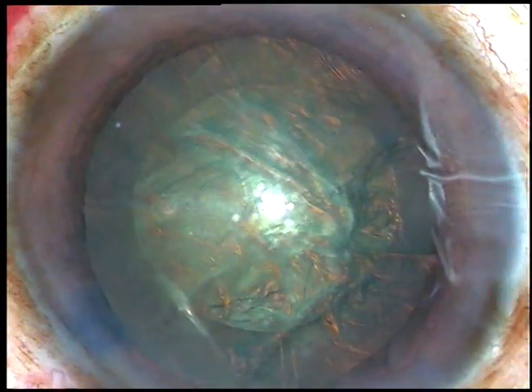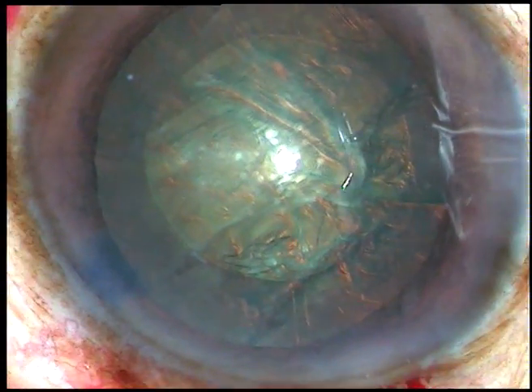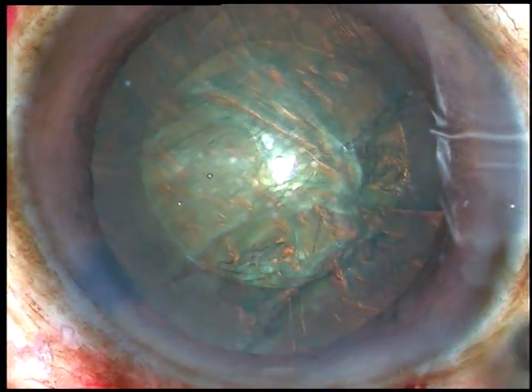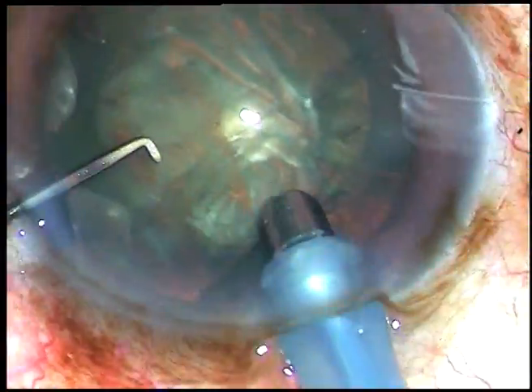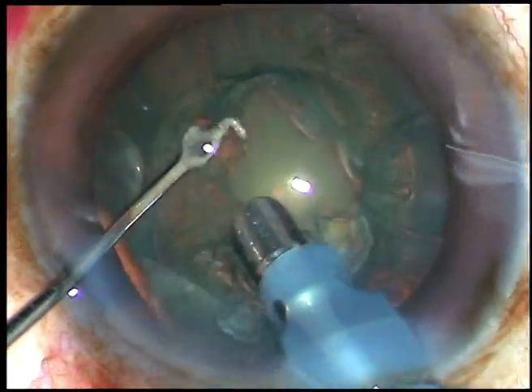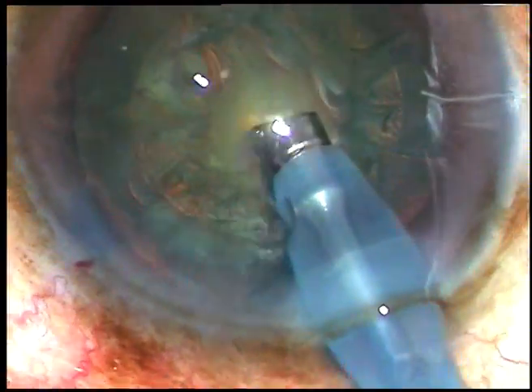Now is the time to introduce the tip of the phaco handpiece. The tip is introduced with its bevel down — this is a 30-degree bevel tip. Now some superficial cortical lens matter is removed, and then the tip is turned to make the bevel up.